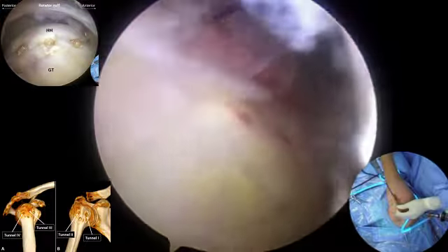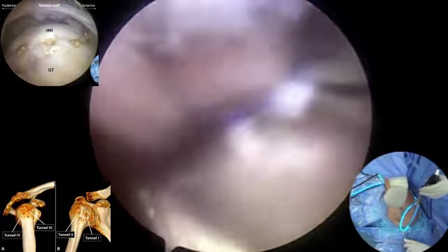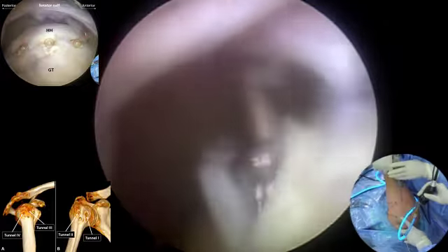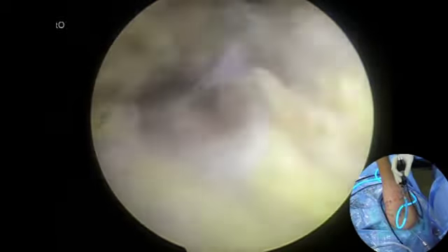The arthroscope is placed in through the posterior-lateral portal. The bone tunnel aiming device is placed in through an accessory lateral portal. Tunnel 3 is created through the middle part of the greater tuberosity. Tunnel 4 is created through the posterior part of the greater tuberosity. Guide sutures are placed in the tunnels.